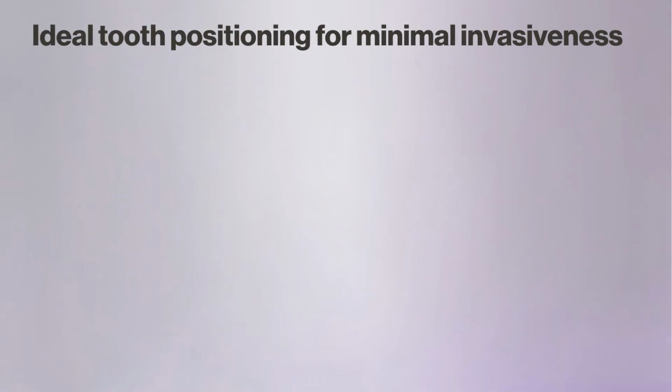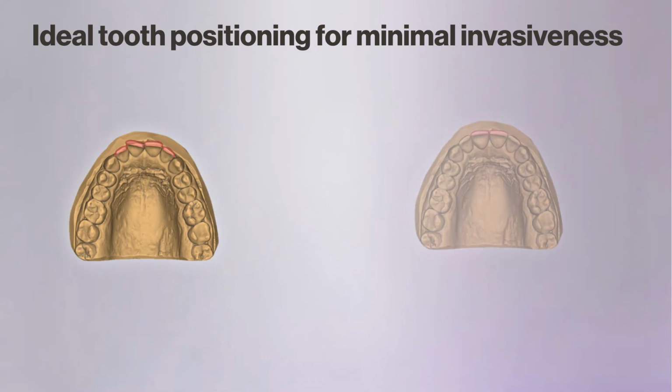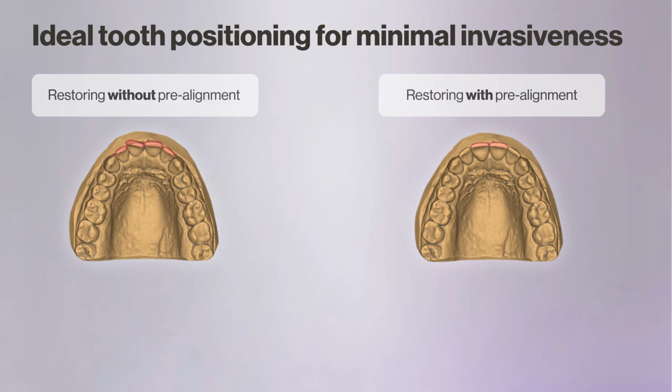Dentistry has evolved in recent years, and minimal invasiveness has become best practice. Whenever we plan a restorative or cosmetic procedure, we should first consider how much natural tooth mass can be preserved and how pre-alignment can potentially favor the outcome.